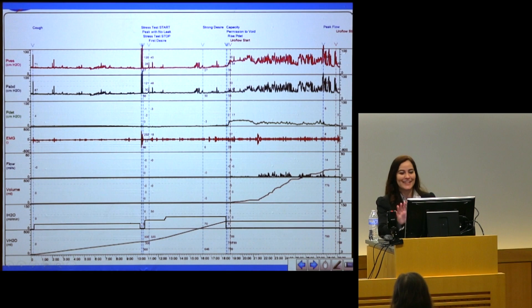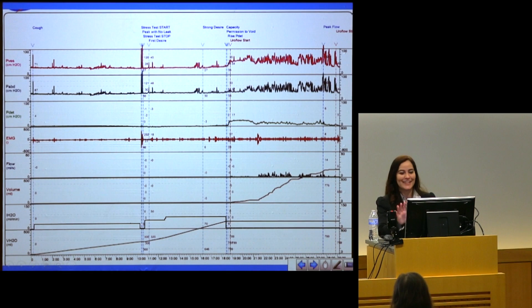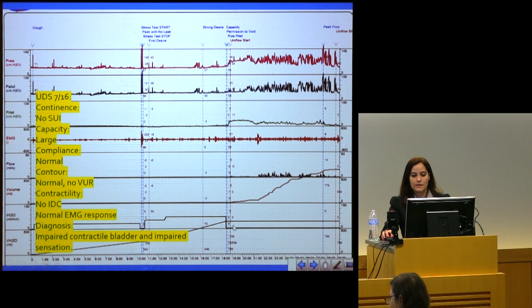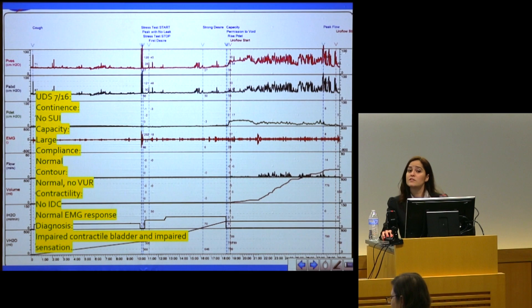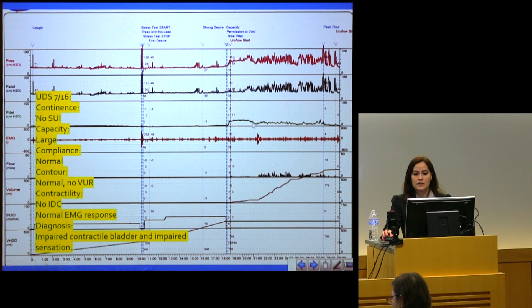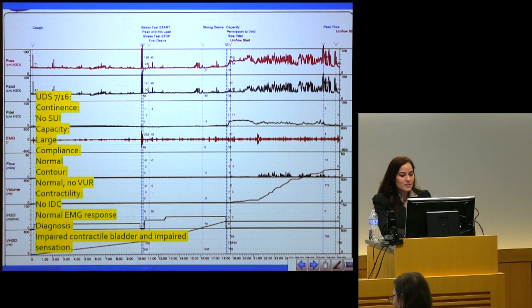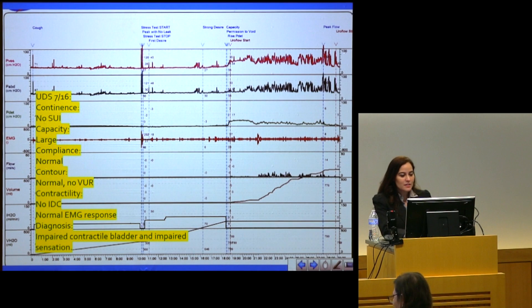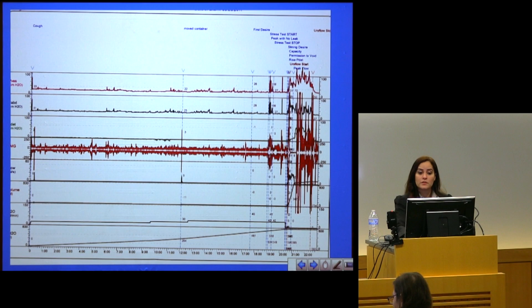I don't expect you to fully interpret the tracing, but I'll point out some key things. This is her filling phase and voiding phase. Her bladder capacity was approximately 700 milliliters — above average, especially for a woman. Her urinary flow is long, prolonged, and flat. And her detrusor function, right here — it's not great, trust me. We can say she had impaired sensation and an impaired contractile bladder, which we now call detrusor underactivity. This is her preoperative urodynamics.